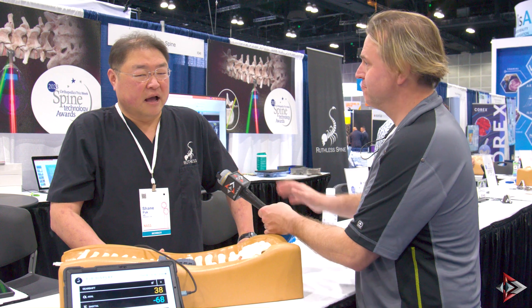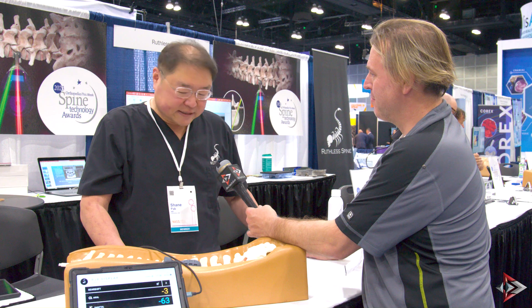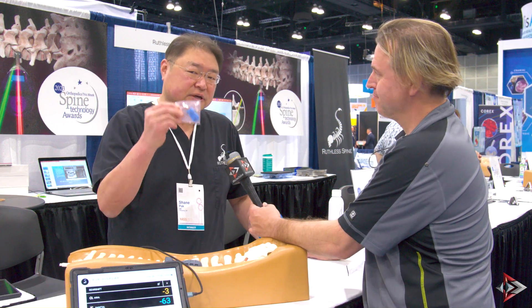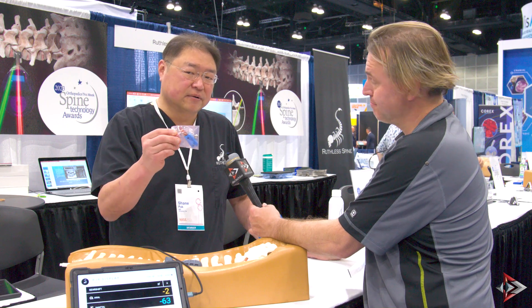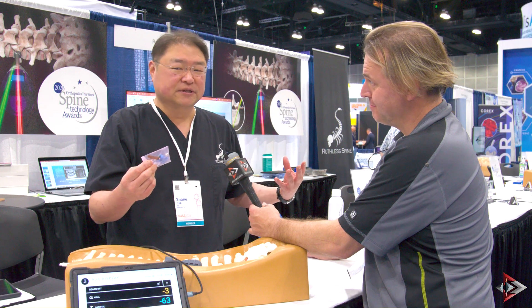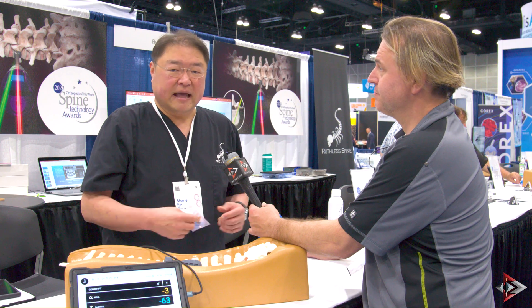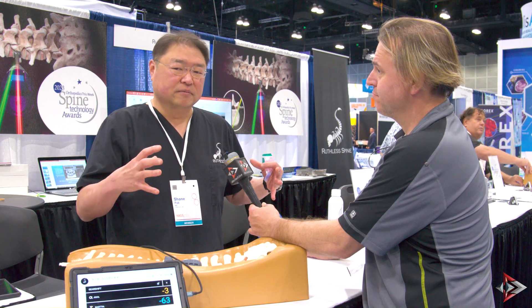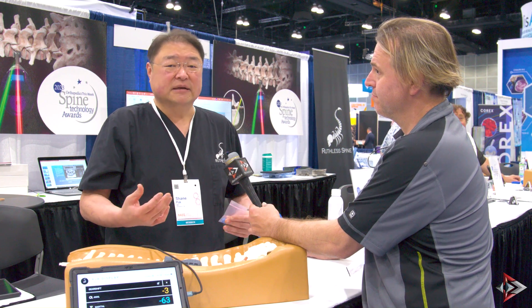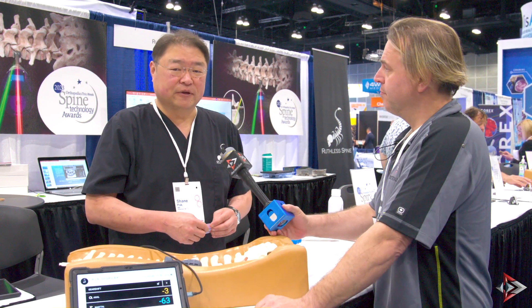Who does this threaten? Here's the thing: if you are interested in a nav solution that requires zero capital costs for your hospital — these are consumables. You tell your hospital: if you use zero, you pay zero. If I, as a surgeon, decide to change my mind and use another nav system, you pay zero. You use 10, you pay for 10. And if you have a small operating room that is space-constrained, or if you want a hospital that would like to not pour money down the drain, then perhaps the RJB would be for you.